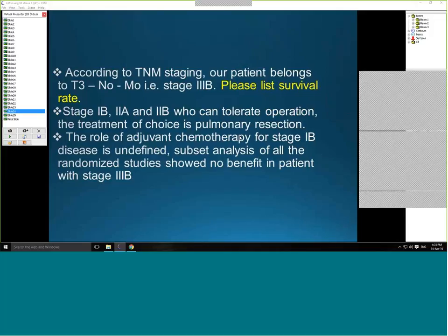Tom has removed the plan on the lung case in order for our students to set up the treatment fields directly on the Vert using contours. Students will begin to use static APPA isocentric fields to encompass the tumor. And I always start with the basic fields because the students must then plan the dosimetric calculations by using wire contouring, TAR calculations, and reviewing the isodose curves.